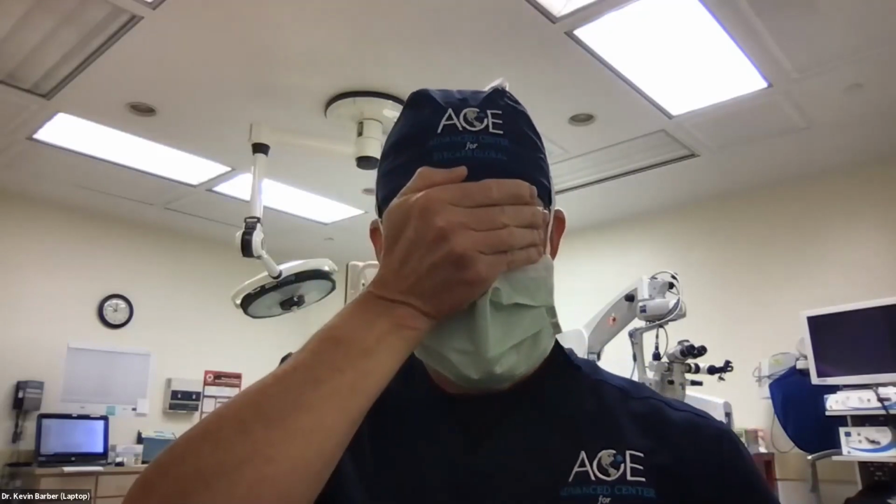Where I see young surgeons get into trouble is when they get some bleeding, they just keep going. It's kind of like trying to drive down the street without being able to see. It's just not a good idea. If you can't see what you're doing, stop. You can go in with viscoelastic and try to blow some of the blood away if it's obscuring your view. Sometimes you have an uncooperative patient and you just can't see the angle. So stop. Do no harm is still our guiding principle that we all learned in medical school. If you can't get a good view, I would always say stop, or just do what you can with the view that you have, but don't try to go beyond that.